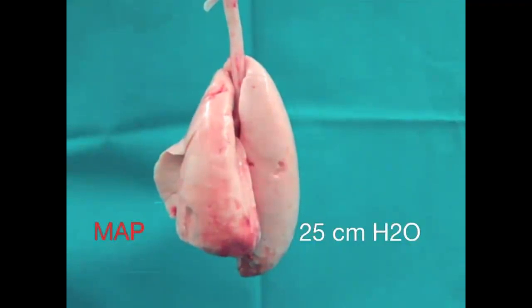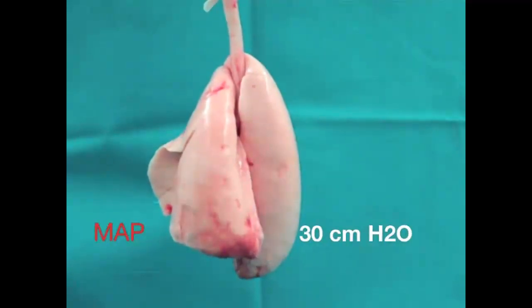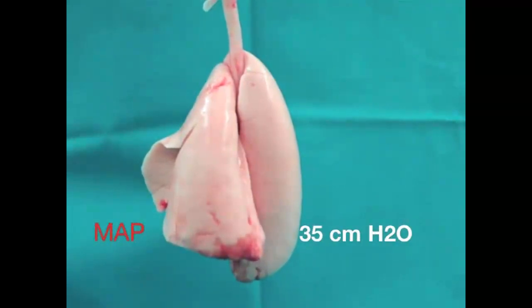You can see there are some areas in the lower, the basal area of the lung that are still closed, and some areas in the front. And if you go to 30, most of the lung is going to be open. So this is a real life view of how we do what we call the open lung therapy when we are ventilating our babies. So let us move to the next slide.